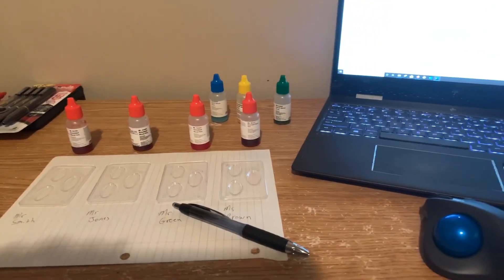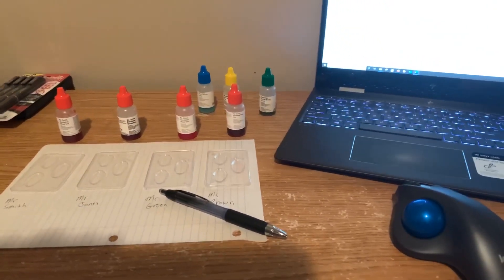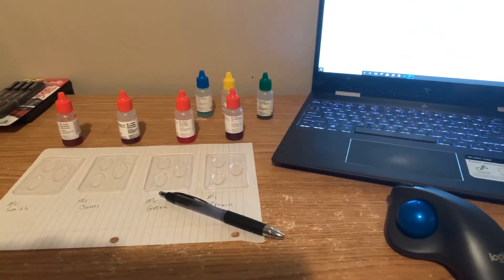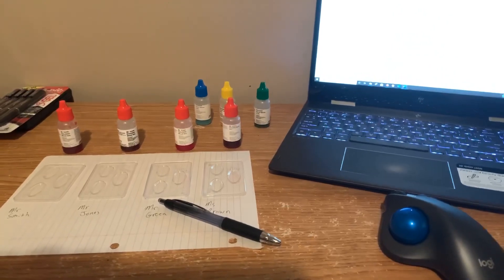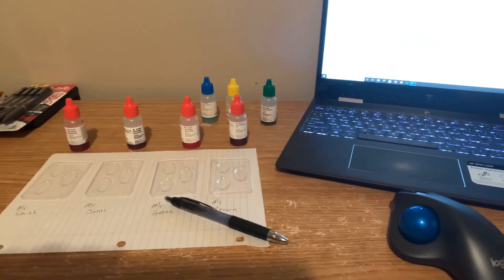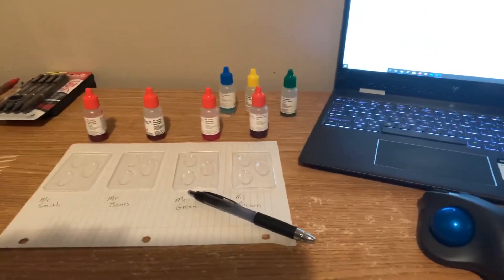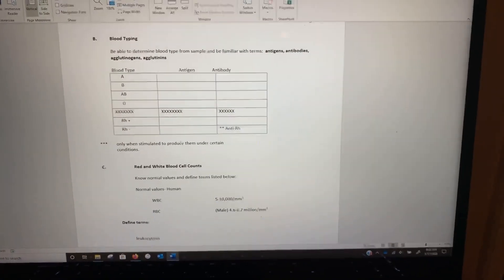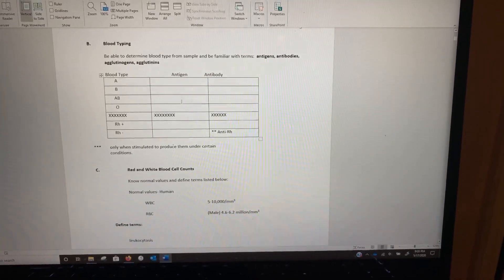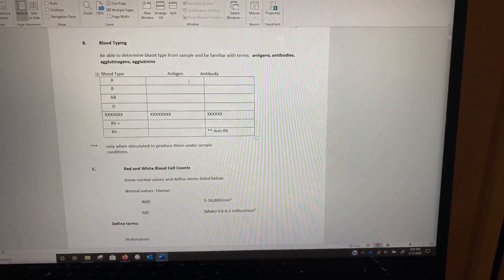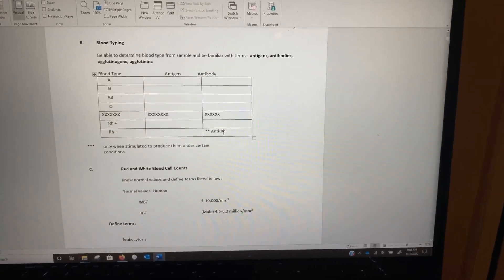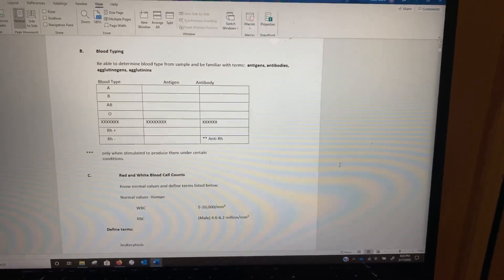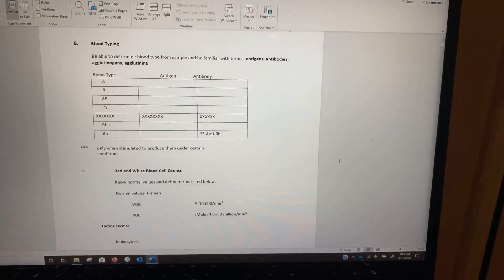Welcome to the first lab online for Bio 139 this semester. This is going to be a walkthrough of the blood typing activity. We're going to begin with this part of the lab. I'm going to walk through what you should have on this table, and then we're going to move on and actually do the blood typing activity.